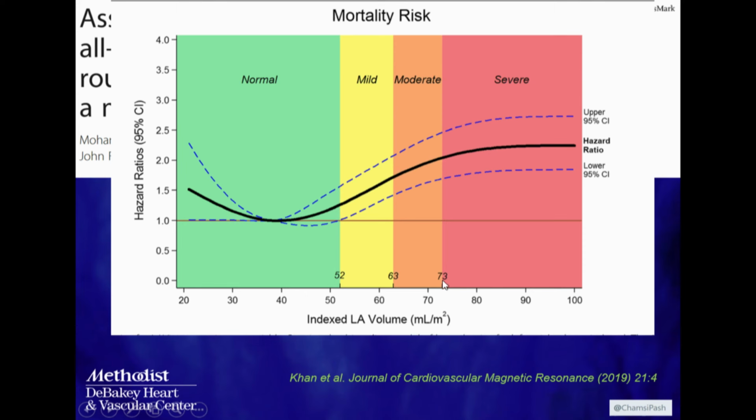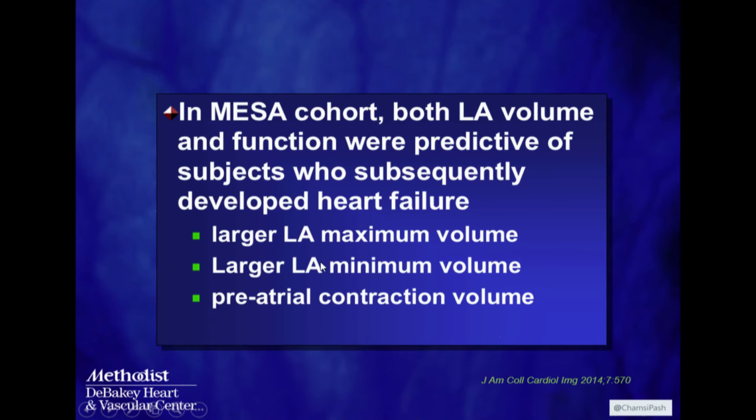So it's the reservoir, it is the conduit along with the pumping or the atrial contraction. And these curves can be plotted with volume on the y-axis and time on the x-axis. So we can see the reservoir, the conduit, and then the active pumping function.